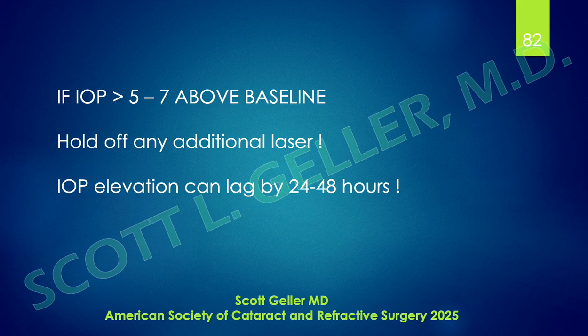So here's a general rule that you can use. First of all, make sure the intraocular pressure you take is absolutely 100% accurate. Aside from a few staff members who I will spot check, I have total trust in my more experienced staff. But if I'm concerned, I might just recheck it myself and make sure that it's within the range, or if I see a disparity between the two eyes. Why is this disparity, 10 in one eye, 20 in the other? Let me recheck this.